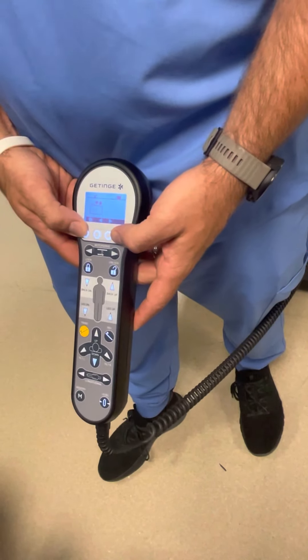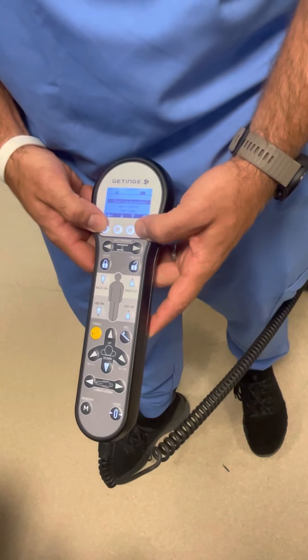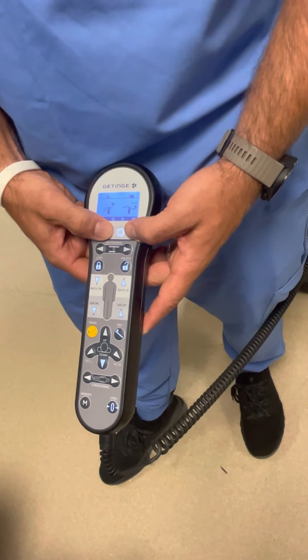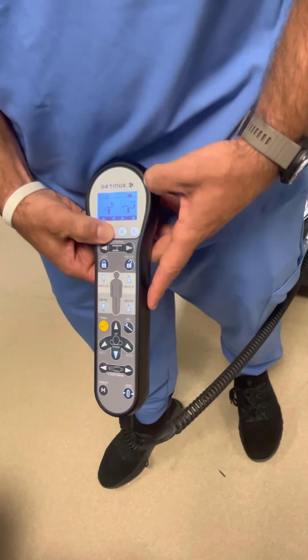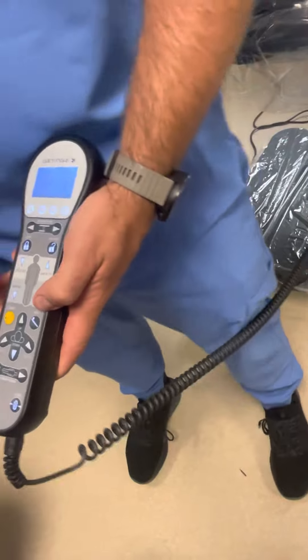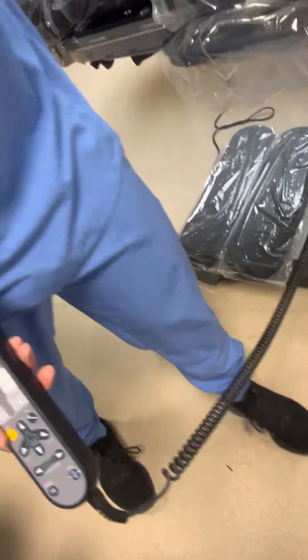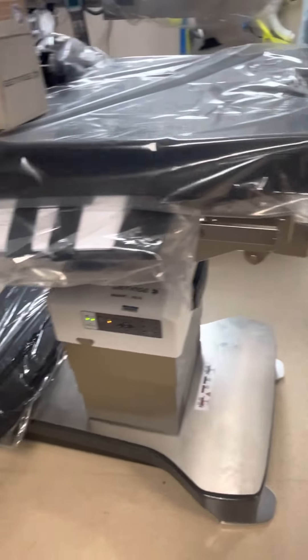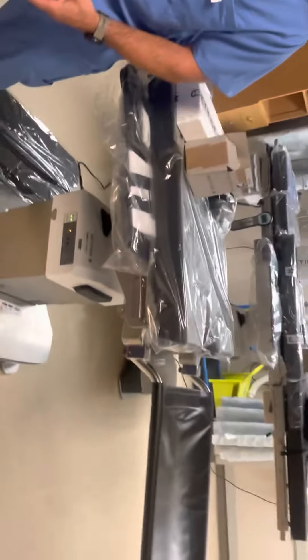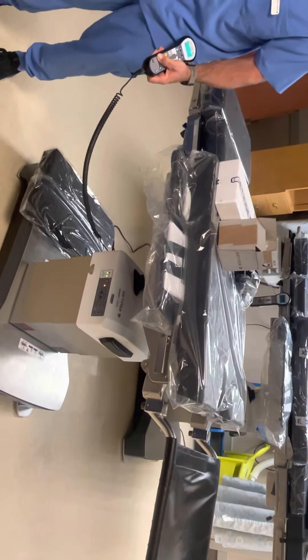Sure, we can help set positions on the bed — there are already 10 on here. Really, all you need is Trendelenburg and reverse Trendelenburg — you've got those buttons right here. You have two motor mounts on this table, here and here: that is your leg plate going up, leg plate going down, back up, back down. You also have your motorized longitudinal shift.